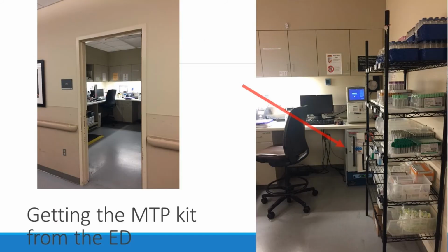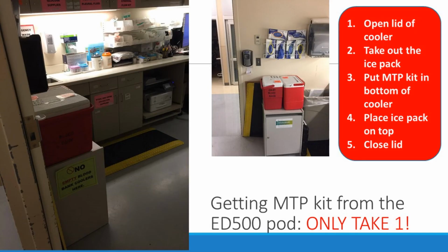So here's the fridge in the ED where the MTP kits are held. There's 2 of them. I know the OR has frequently come down, and they can pull from there as well. You can see the coolers here, so you want to take out the ice pack, put the MTP kit in, place the ice pack on top, and close the lid. And only take 1. The other kits are for other situations, other floors.